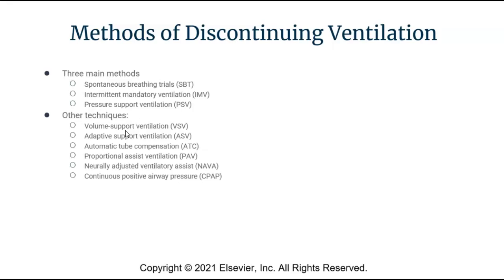NAVA, we've talked about, is neurally adjusted ventilatory assist, where the patient has a catheter in their esophagus measuring diaphragm activity, and that's how it's triggering the vent. So it's forcing the patient to use their diaphragm, and then just straight CPAP, which is also acceptable.